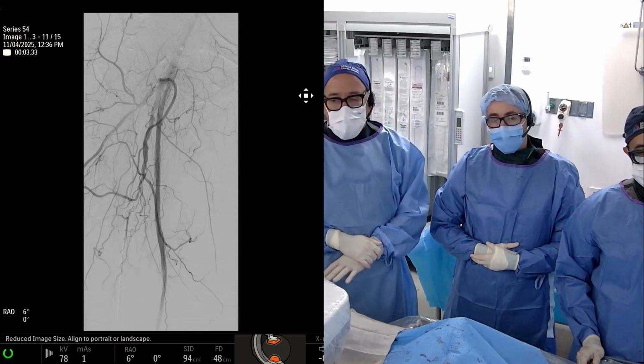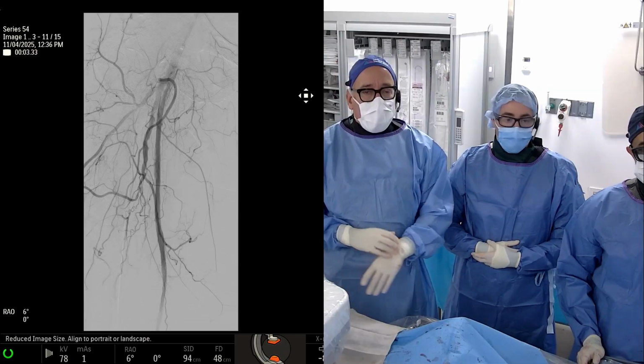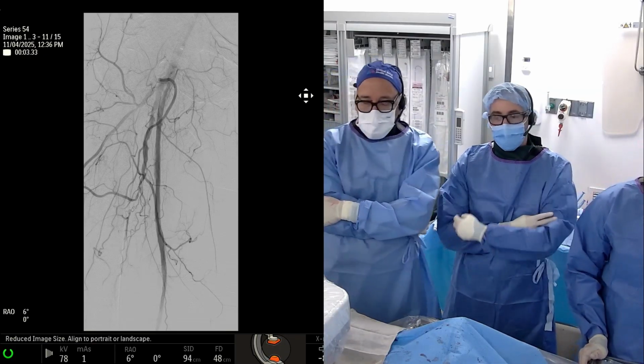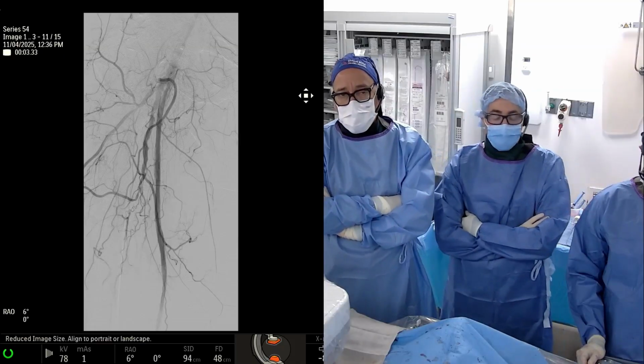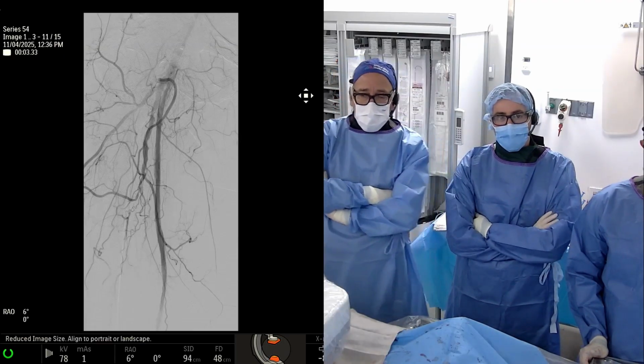But I think it was a more diffuse treatment than a more focal treatment, if that's what you were going at. I'll say that I agree that E8 really gives you a lot of treatment zone with 400 shocks. I personally oversize pretty aggressively, though. I would be much more comfortable, because you're at low atmospheres, to push it to a 7. But looks like you have a great result.